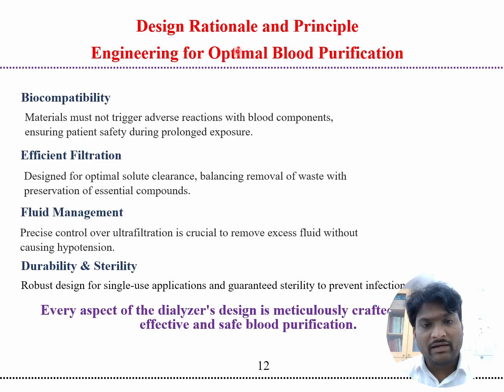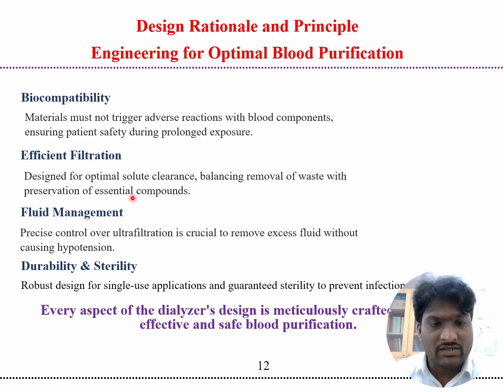And the design and the principal engineering of optimal blood purification, like biocompatibility. The materials must not trigger adverse reactions with the blood components, ensuring the patient's safety during prolonged exposure. Efficient filtration is designed for optimal solute clearance, balancing the removal of waste with the preservation of essential components.